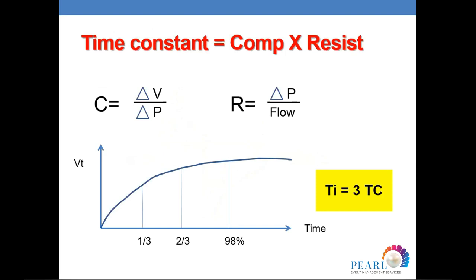Another concept, very, very important, is the I time. We know that we need to keep the I time for a preterm infant at, let's say, 0.3, 0.25, 0.35. On which basis do we determine this? Actually, to reach your I time, you need 3 to 5 time constants. And the time constant depends on what? It depends on the compliance and the resistance. Just to understand it.